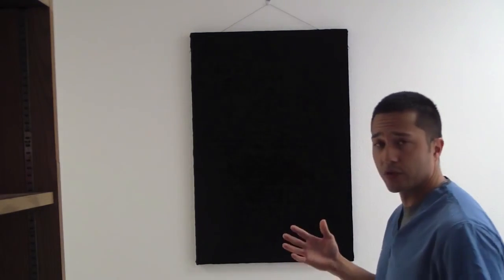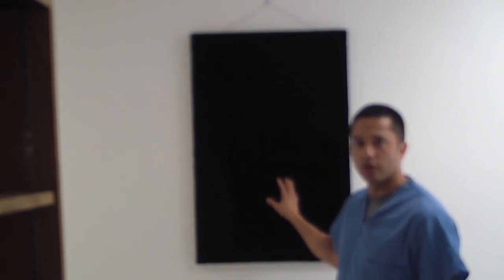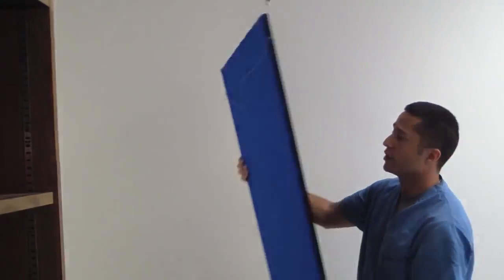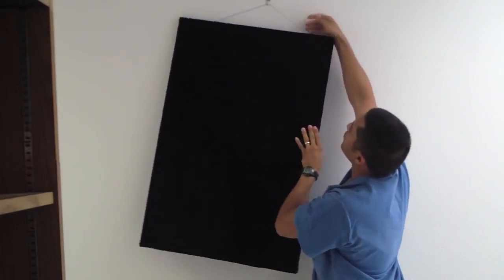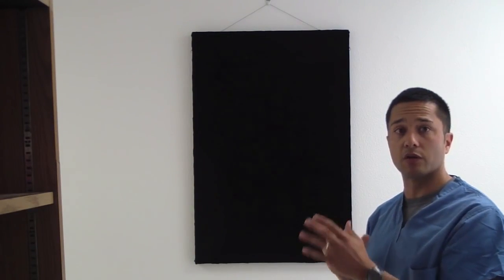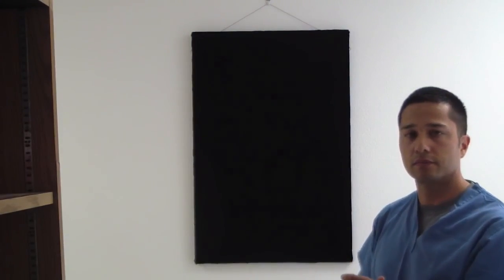So the first thing that we typically do after your examination is we'll take them to a background. Now we have a black background. We can also flip this, and it's a blue background. The reason why we do this is because we do a number of presentations, and it's easier to crop the picture of the patient when there's a black background compared to the dental chair. So it makes it easier for presentations.